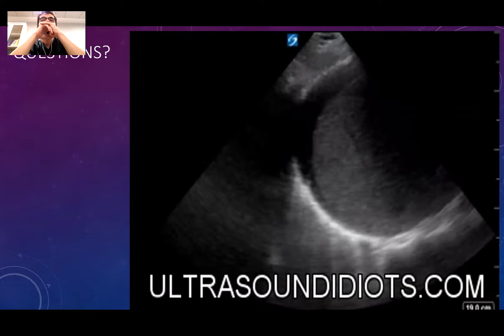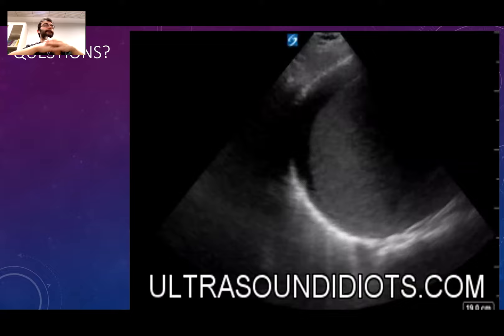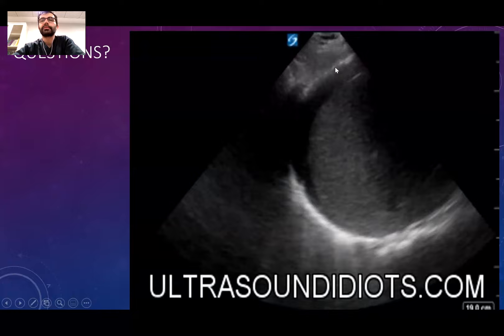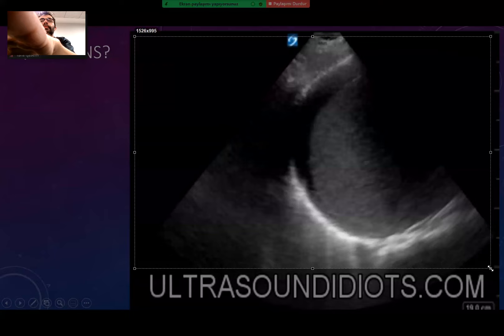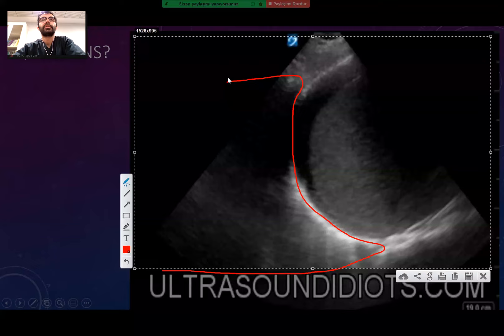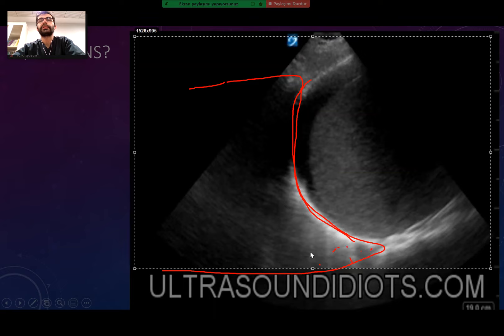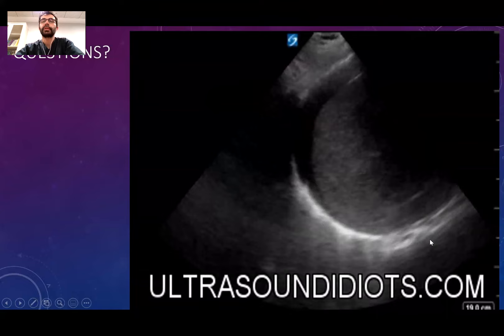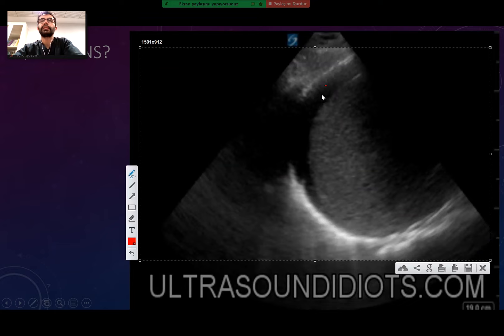Another case: we see the diaphragm and lungs are not swimming. There is fluid visible here, but it is basically under the diaphragm — subdiaphragmatic free fluid. This is free fluid; if it were above the diaphragm it would be pleural fluid.